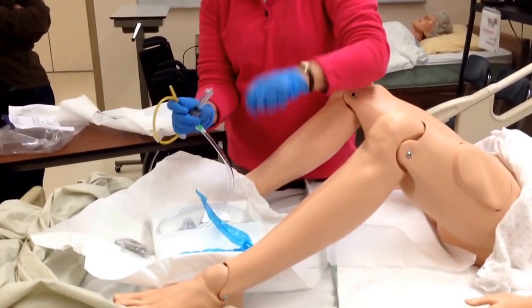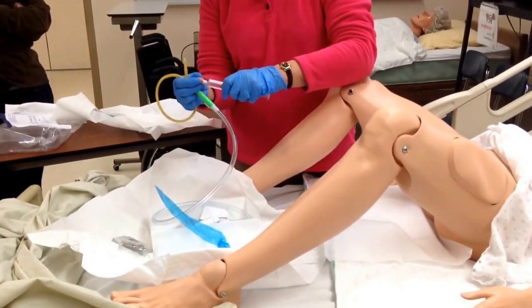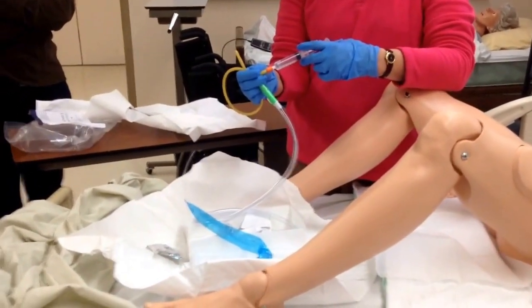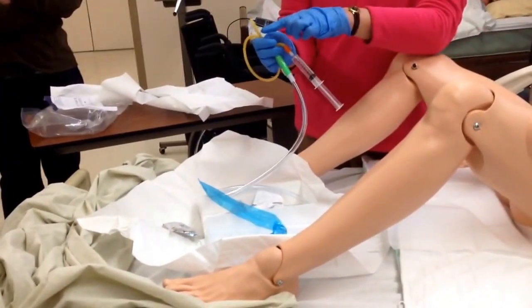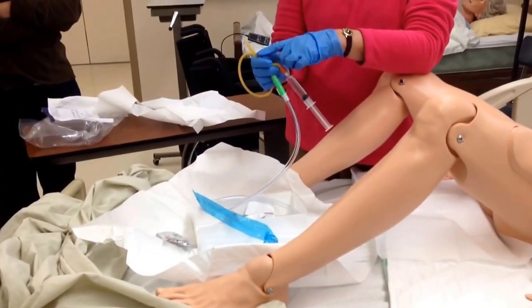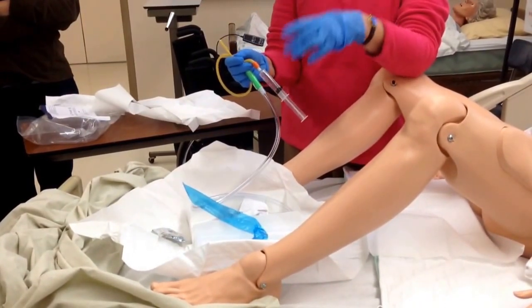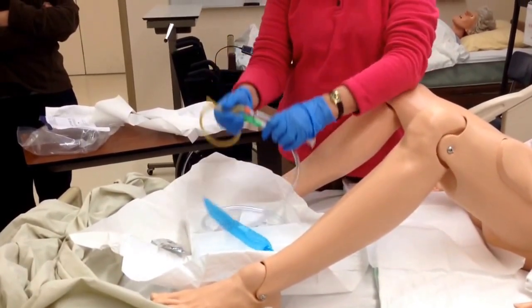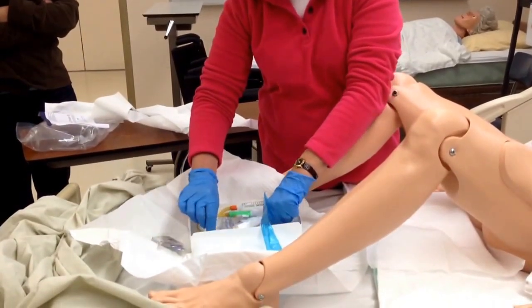Then you're going to take your cap off the syringe and just attach it to the end of the balloon port. We used to be able to test the balloon before we inserted it, just to make sure that it did inflate, but we don't do that anymore because it supposedly weakens the balloon, okay? Which, if it isn't functioning and you put it in and you go to blow up the balloon, it doesn't blow up, the catheter's coming out, and it's going to leak. So I'm just following policy now. You don't inflate the balloon. So we're just going to put everything right back here, very carefully, and keep it inside this little box.